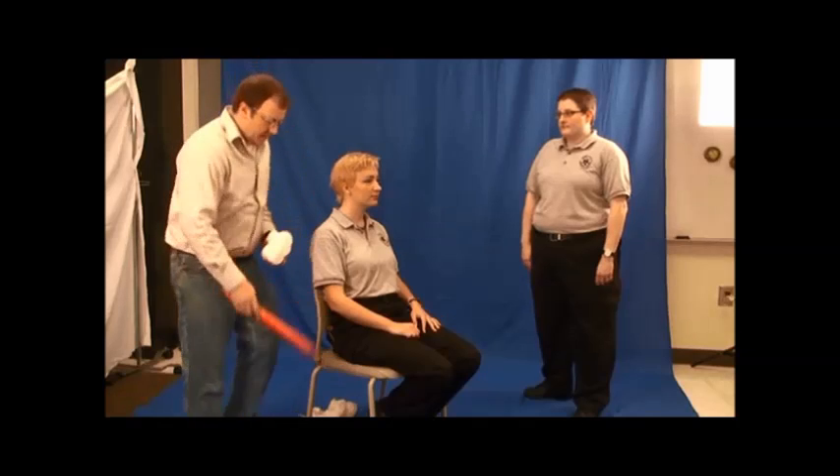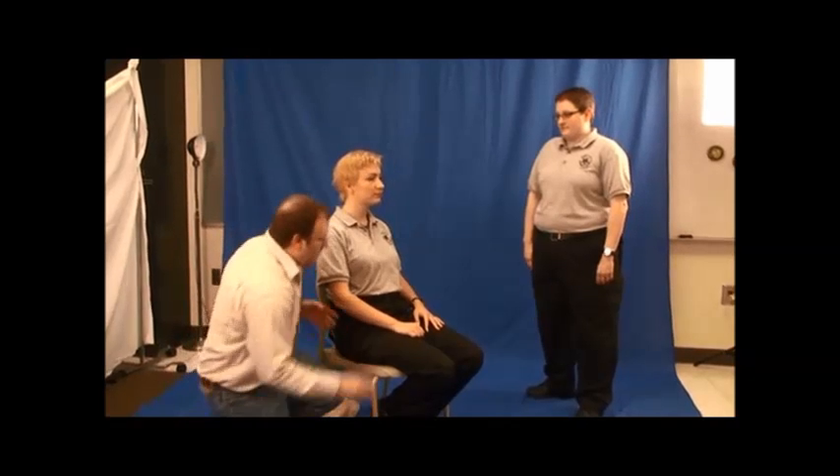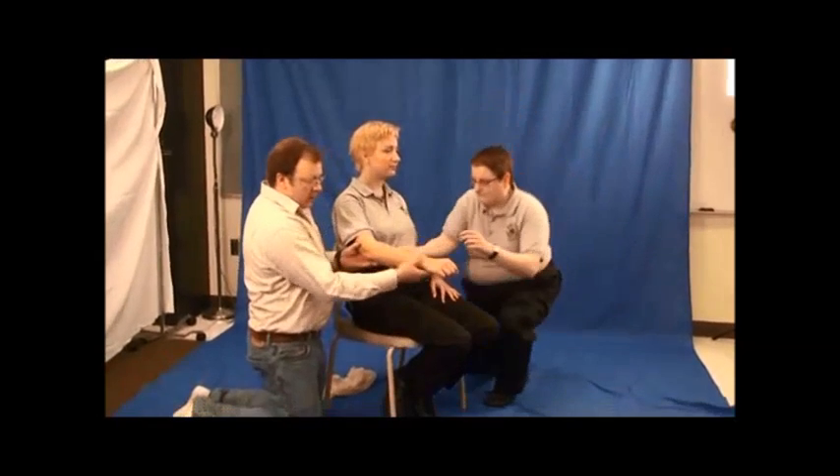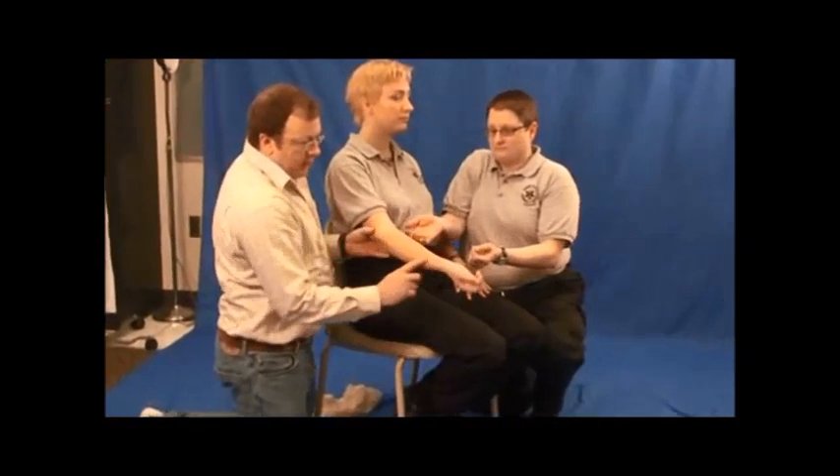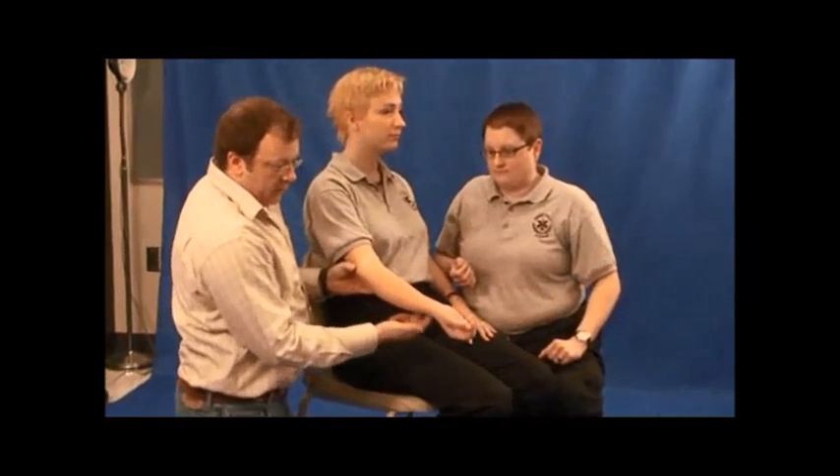This is stabilization or splinting of a forearm fracture. The forearm consists of the radial bone and the ulna.